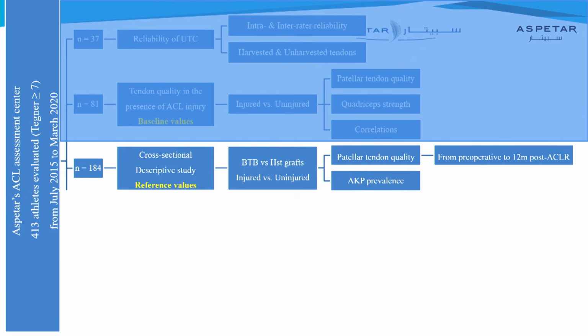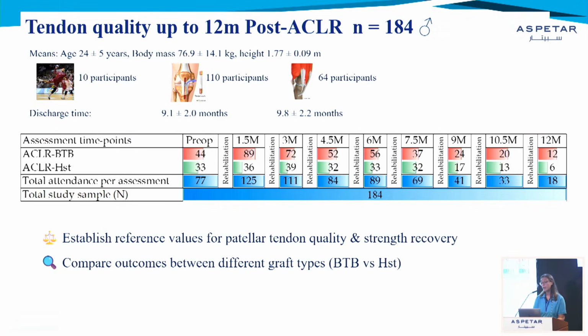Very good. Then we go, okay, now we need to see that in the long term, right? So we assessed the patients from pre-op to 12 months post-op. But in this case, I included everyone. I wanted to see the reference values for each time point and to assess anterior knee pain prevalence.